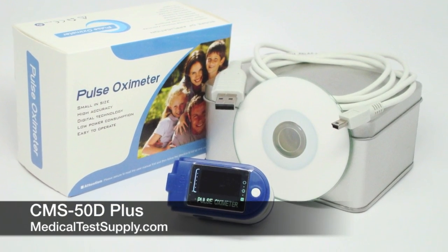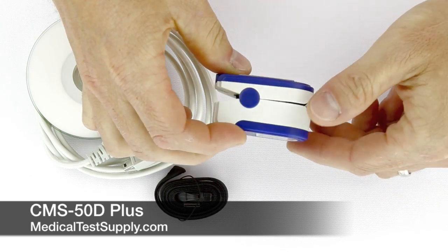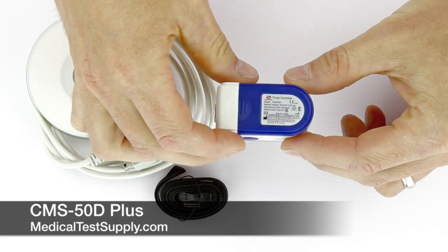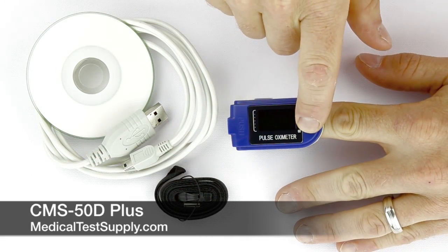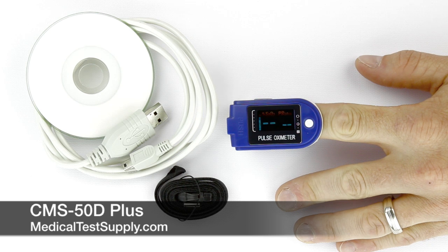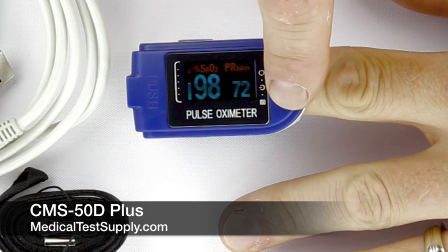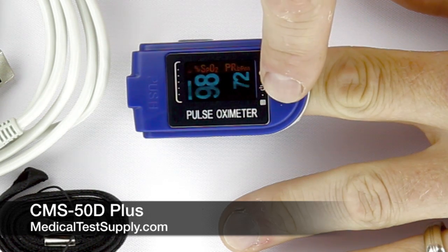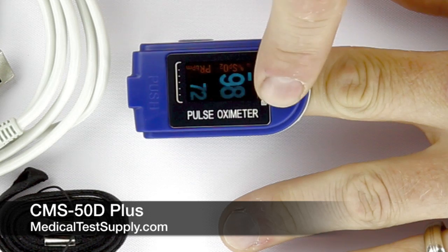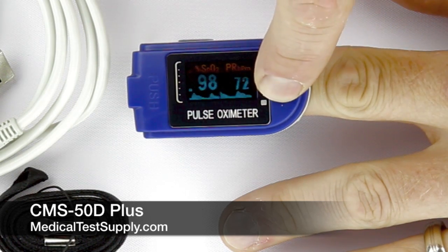The CMS-50D Plus is a full-featured finger oximeter and the most reasonably priced here at MTS with a full memory function. It has a 24-hour memory for storing oxygen saturation and pulse rate information, and comes with full-featured software for reviewing and analyzing oximetry data. The device is operated using just one white button on the face, which allows the user to change the display orientation and utilize all the menus for controlling the device.